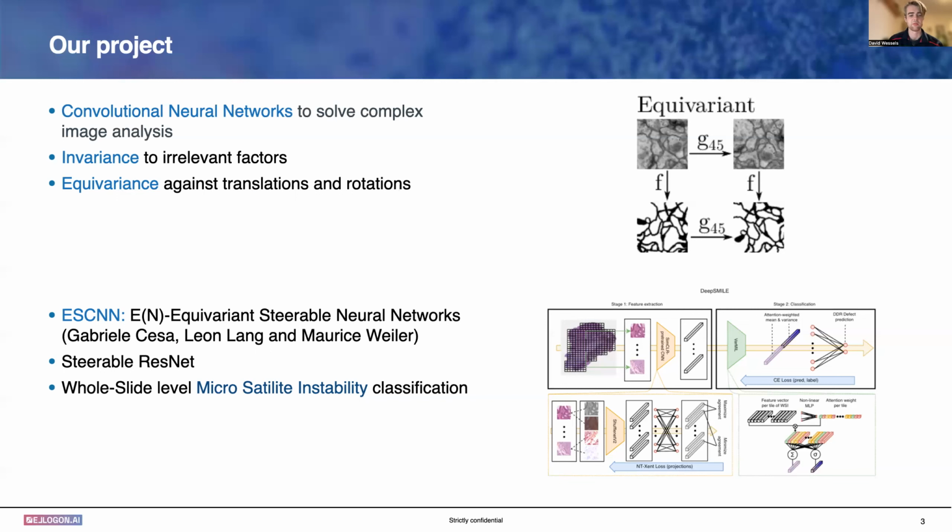Progress in geometric deep learning has shown the power of proactively equipping models with geometric structures as inductive bias. For this project, we worked on incorporating progress in geometrical deep learning by implementing models equivariant against global rotational and translational symmetries within the histopathology pipeline of Ellogon.